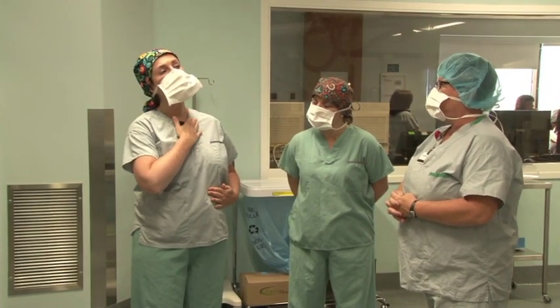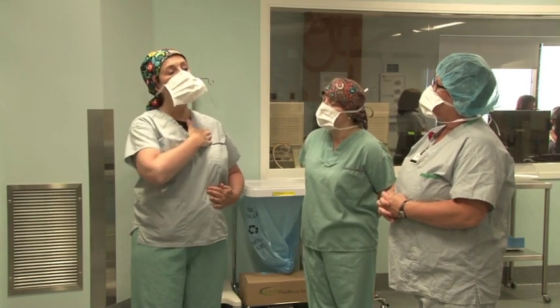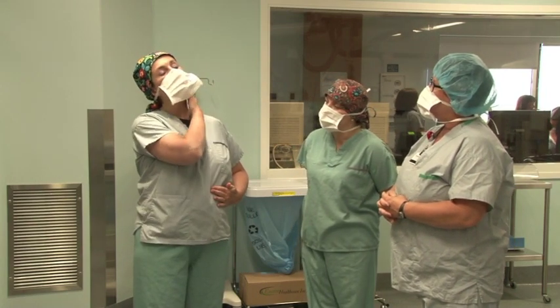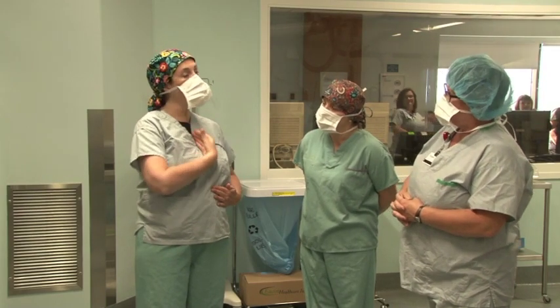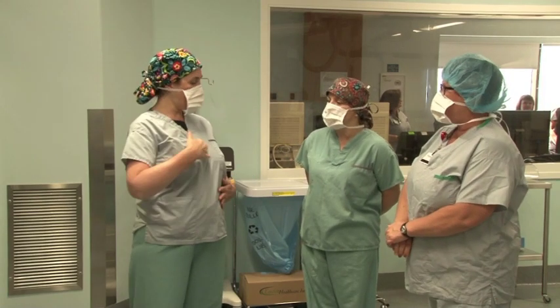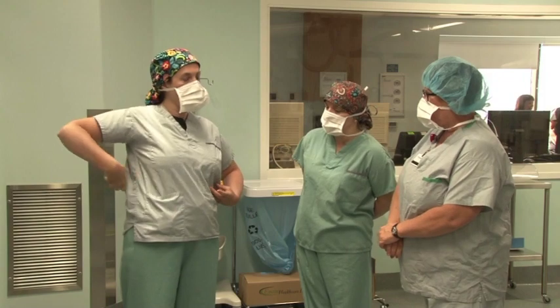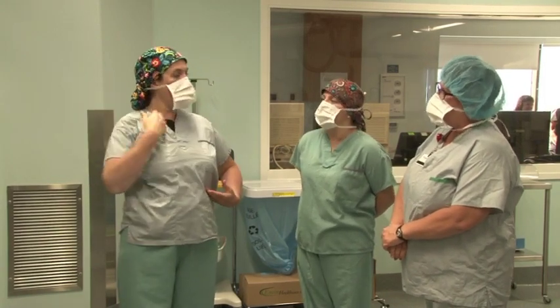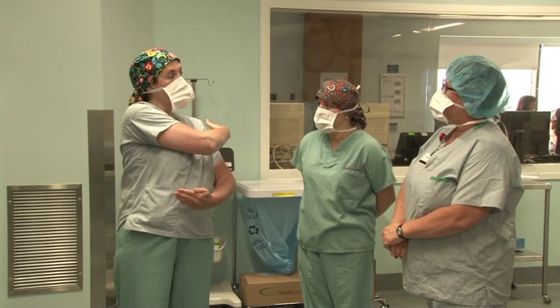When we prep the patient, we do 2 washings, 2 skin preps here in the room over the subclavian area. We're very generous in size, again, to reduce the risk of infection. We also want to have this area prepped in case we ever have to do a pericardial tap. So we don't want any wires at all in this upper quadrant area. The wires just have to be positioned down below or up over. Just keep this area clear and any wires below the shoulder.